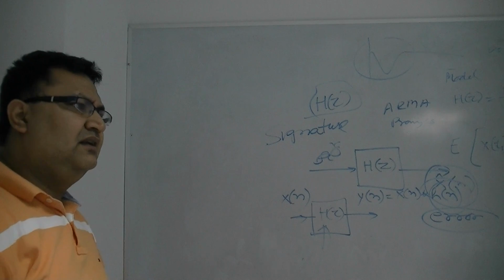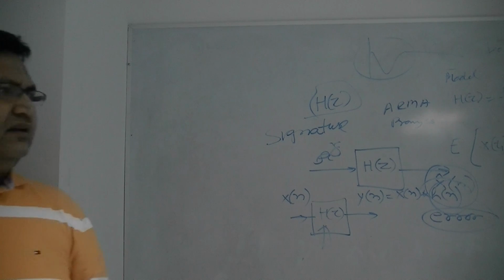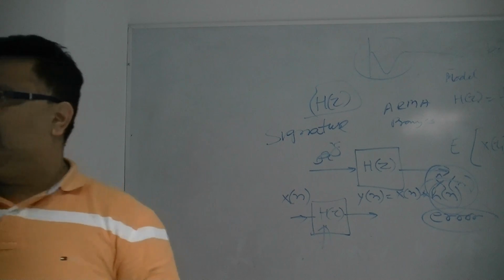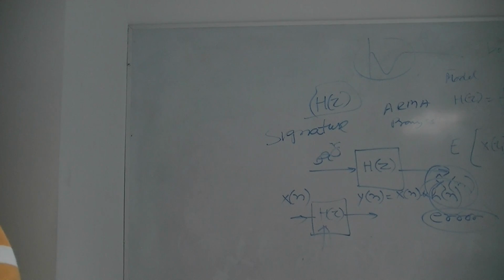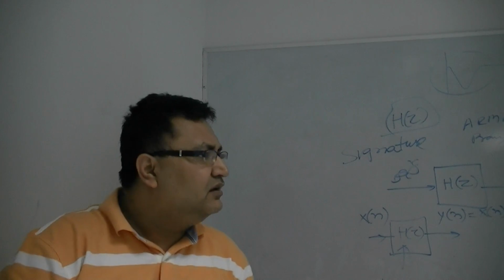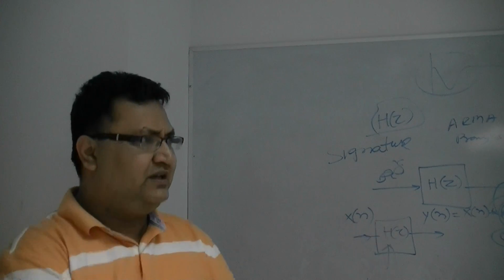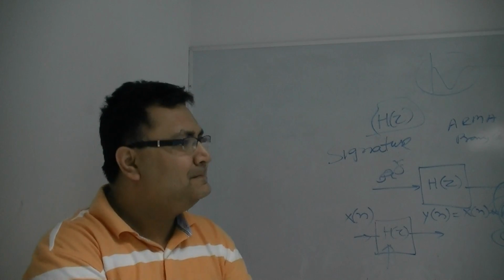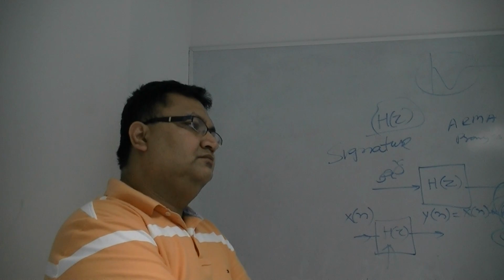Comparing, you need to calculate some distance between this type of signal and that type of signal. That type of comparison can be done like, we can use correlation between two signals. We can check whether they are correlated or not. If one is x1, other is x2, we can find out a correlation. If you shift the time series a bit, the correlation can be very different.